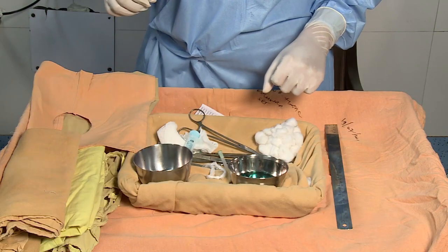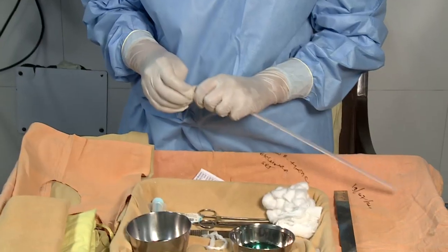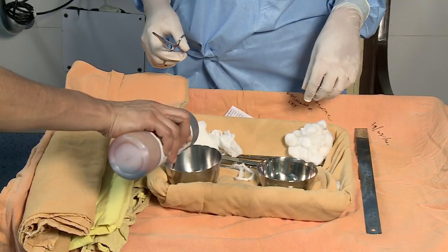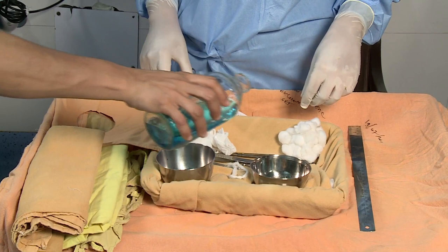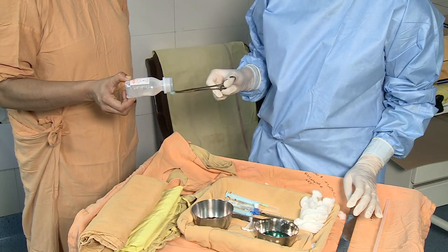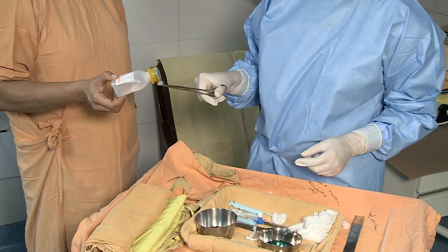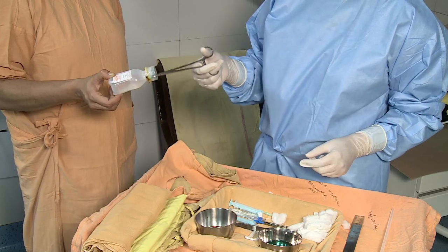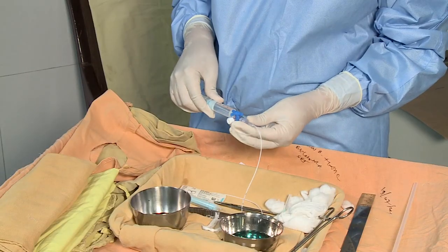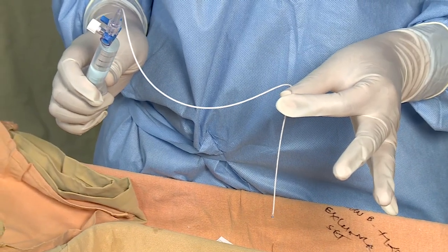The circulatory nurse opens the exchange set, syringes, and umbilical catheter in a sterile manner. Pour the antiseptic solutions in the bowls, and clean the mouth of the saline bottle using triple swab technique. Fill the syringe with saline with the help of the circulatory nurse. Attach the stopcock to the hub of the catheter and fill the system with flush solution, then turn the stopcock off to the catheter.